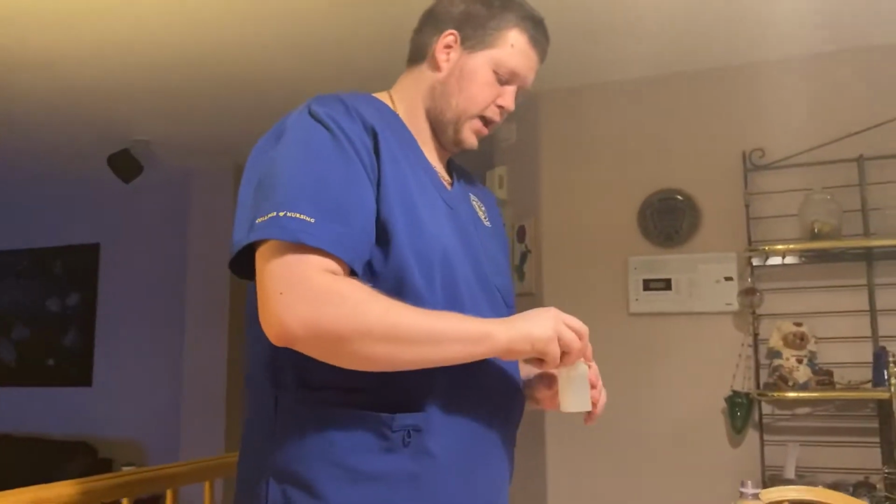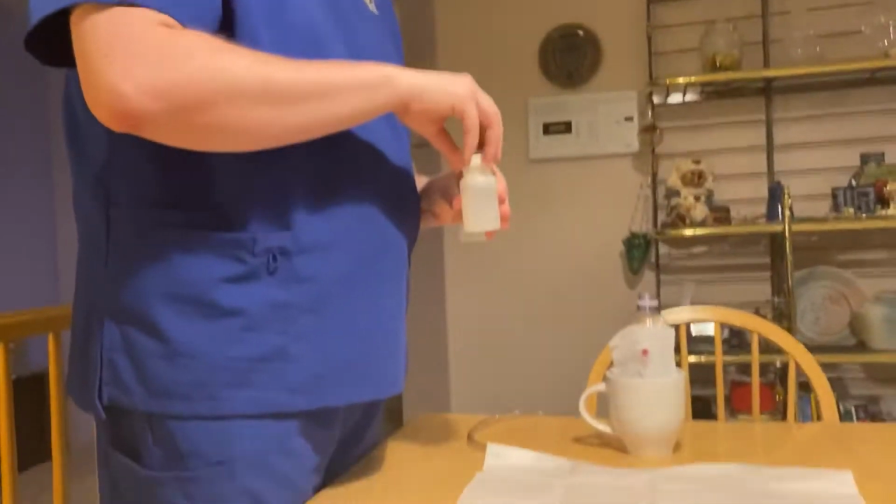If it ever dropped too low, I would stop what I was doing and put their mask back on so they can breathe. And then I would auscultate the patient to check whether there's anything in their lungs or in their trachea that I would clean and suction out. I would do this before and after. My next thing after all that, I would open up my sterile saline.